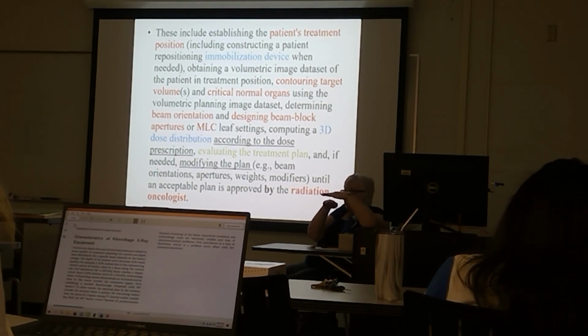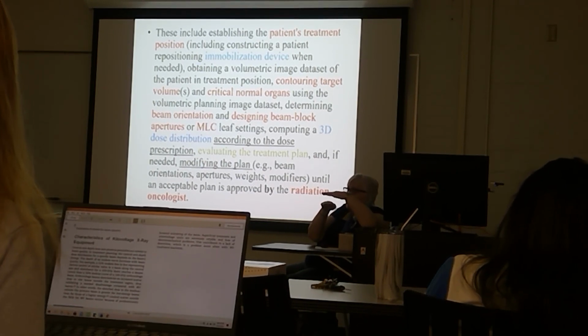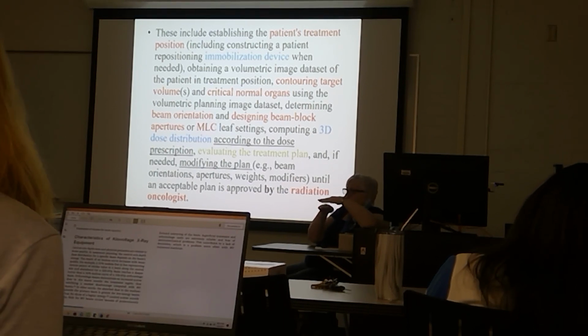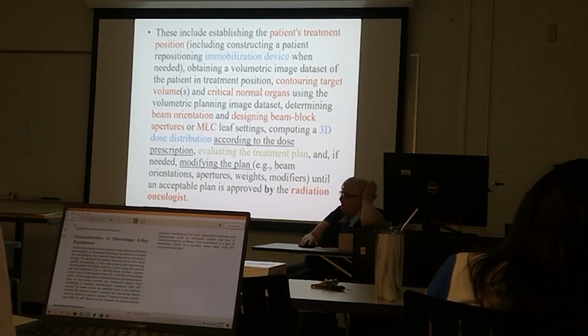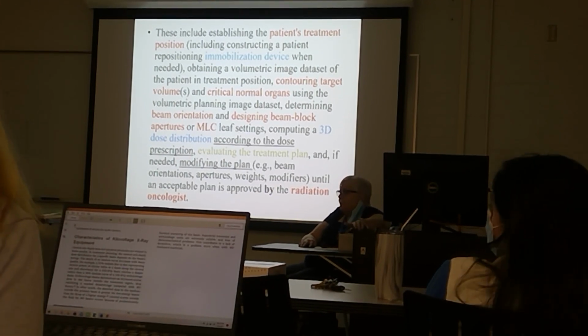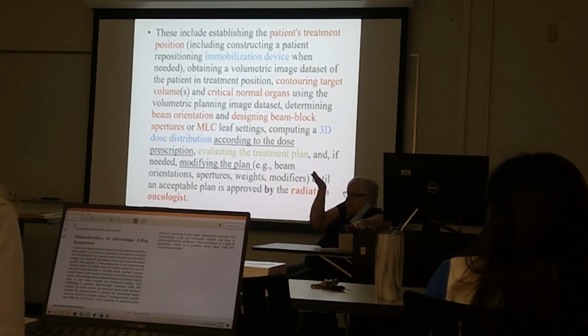where will that put it? Will that move the isocenter anterior or posterior? You're doing more from the posterior side? Yes, the posterior. If the majority of it's going down towards the posterior side of things, I would think it would be posterior. No, the majority is coming from the posterior.